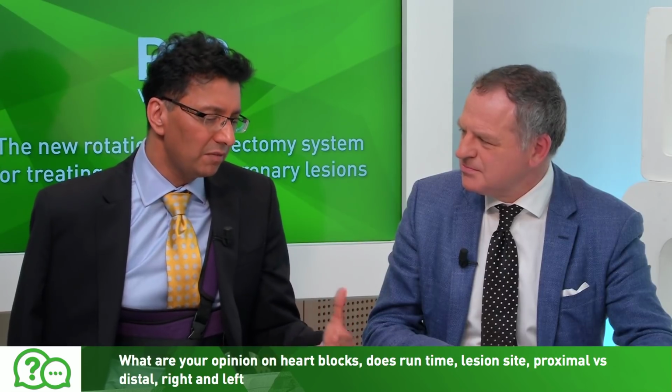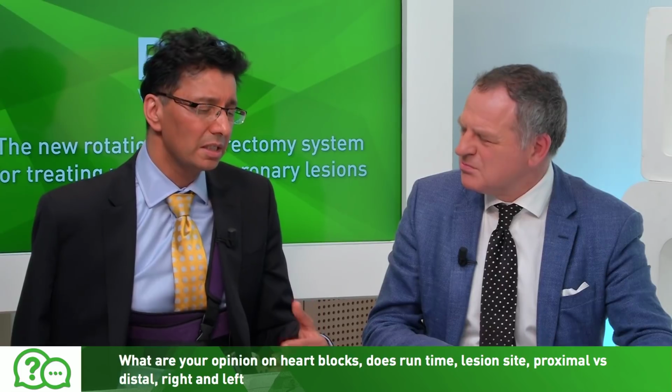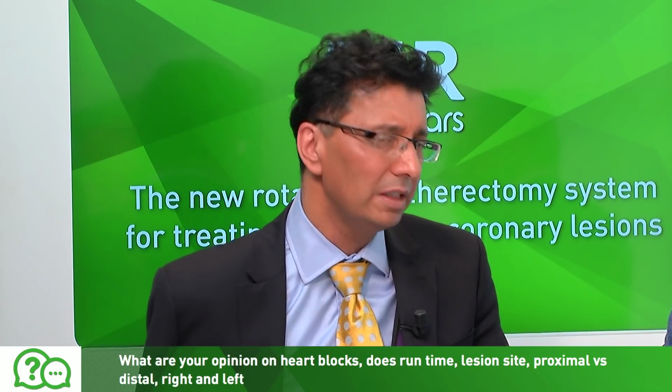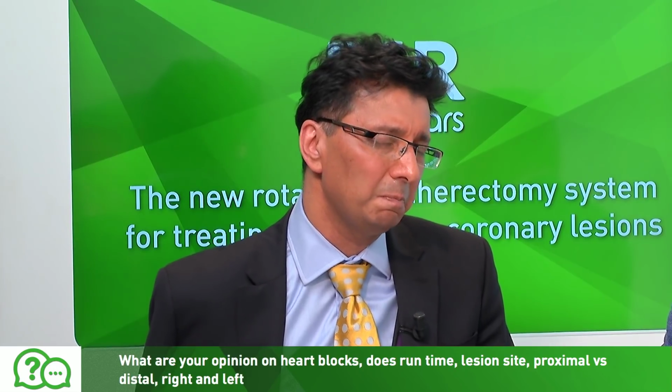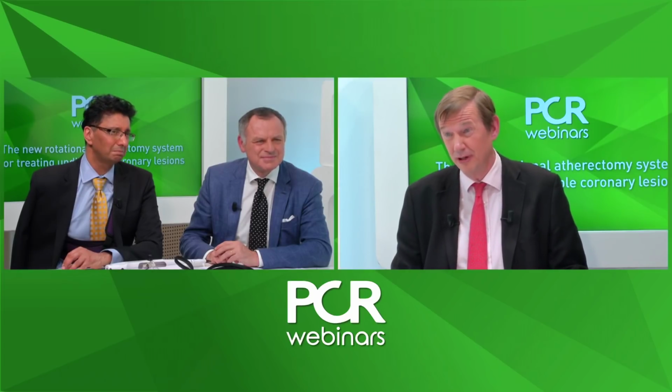But I think the emphasis also is on using as safe a pacing wire as possible. And there are pacing wires and pacing wires. Some of the balloon tip 5 French very atraumatic pacing wires definitely have got a place in this. Certainly, some of the more aggressive techniques I saw in the past, where they used pacing wires but also 2B3A inhibitors, were a recipe for potential bleeding and problems from RV perforation. And interestingly, these newer, gentler techniques mean that it rarely happens, and if it does, it's usually very temporary. Is that your experience?